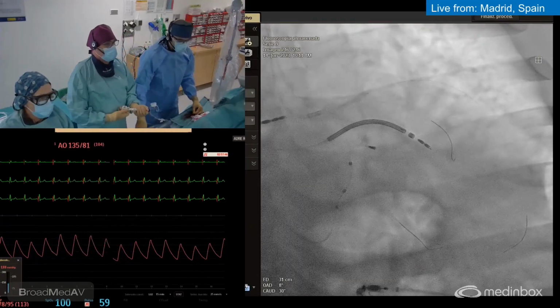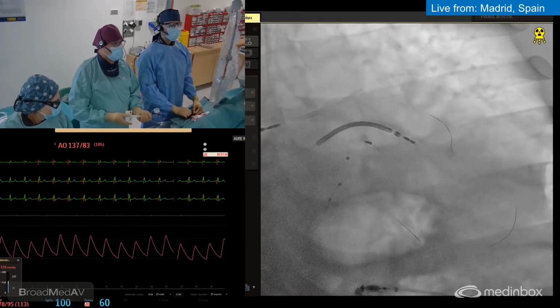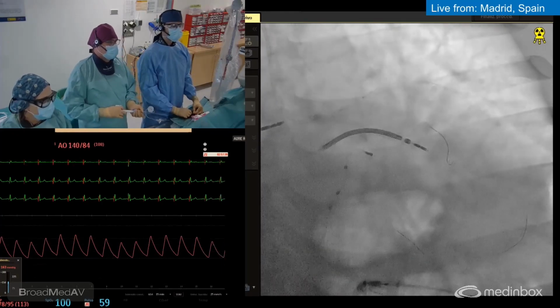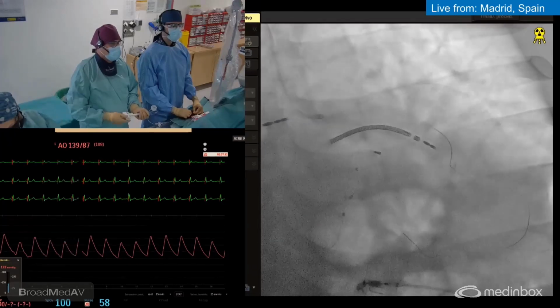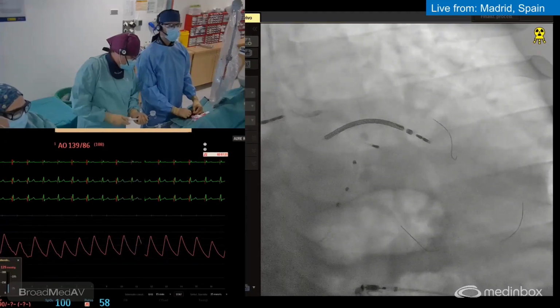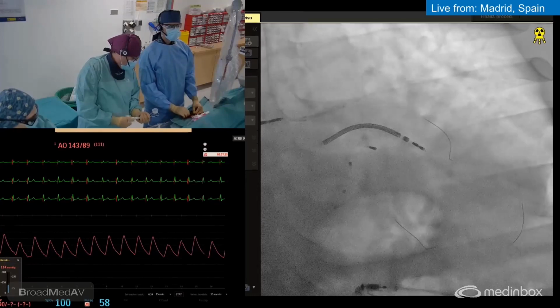You need to have a plan A, B, C, and D in these cases. Okay, perfect. So let's do a fast dilatation in the left main and then go with the 3.5 balloon. Ahí está. No sé si lo tenemos. Pues rápida, 18. Luego vamos con el grande, ¿sabes? Sobre todo no pillar la parte muy sana, ¿no? Ok, vale.